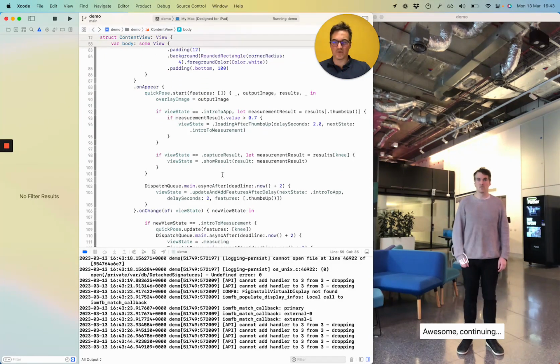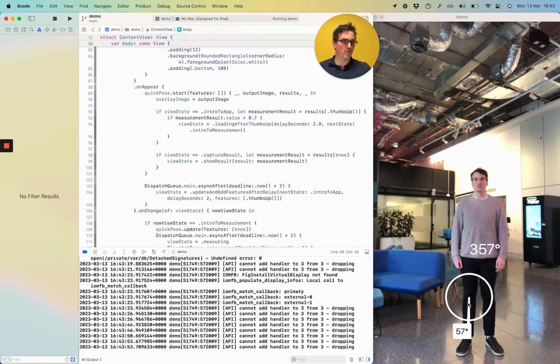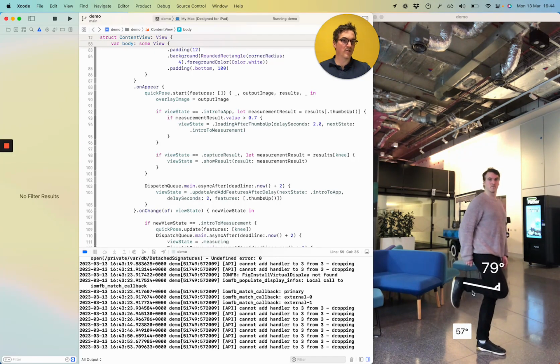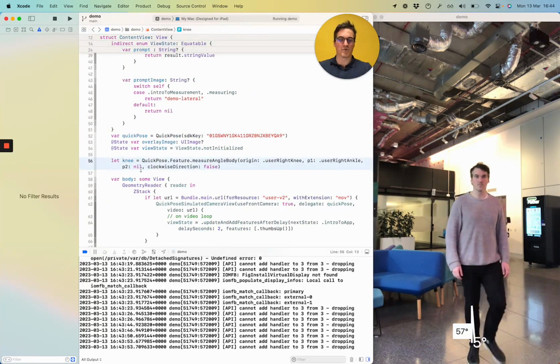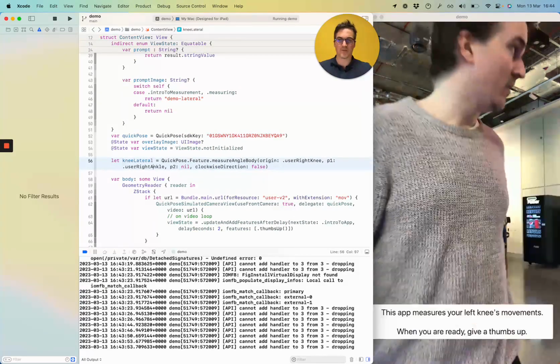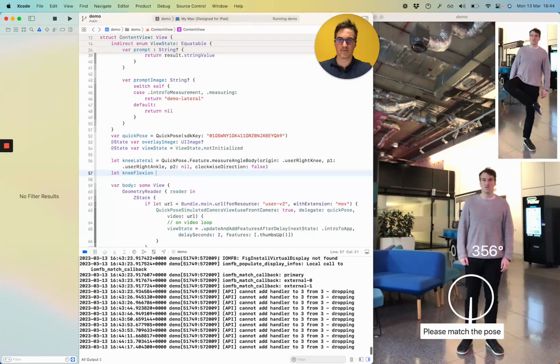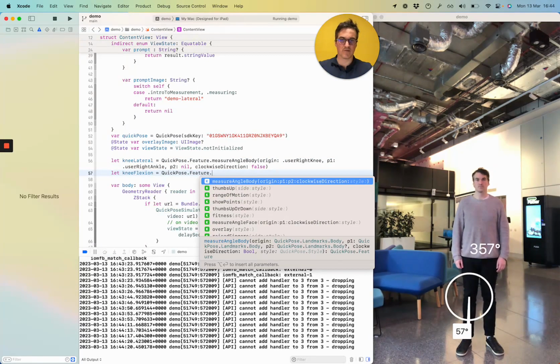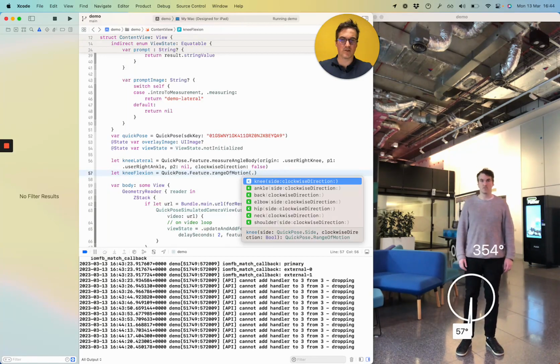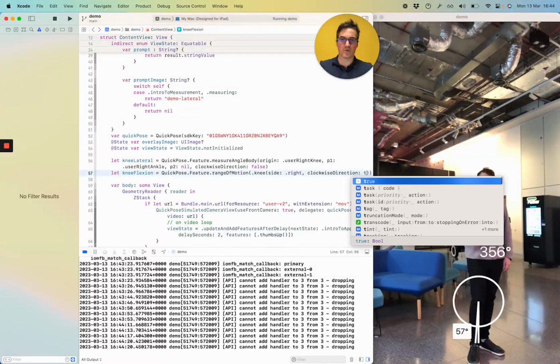The other steps we can do here is go on to change the value we're measuring. So at the moment we're measuring one value. I'm saying it's 57. And then I'm going on to measure my other value, which is my range of motion here. So in a way, we want both features. So I'm going to call this first one knee lateral, and I'm going to call my second one knee flexion. So this was the same value we had before. It's a range of motion of the knee. The side is my right, and this one is clockwise.